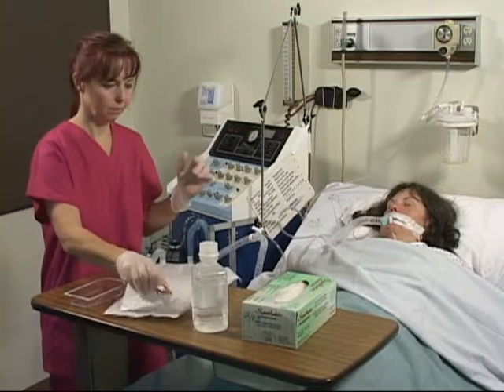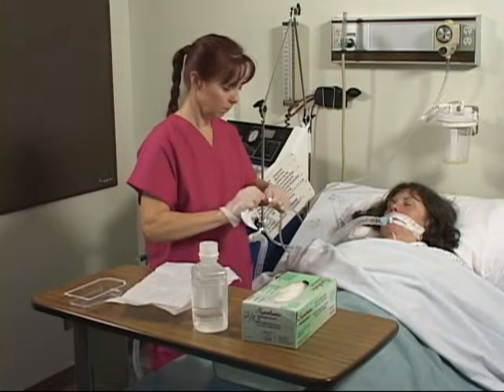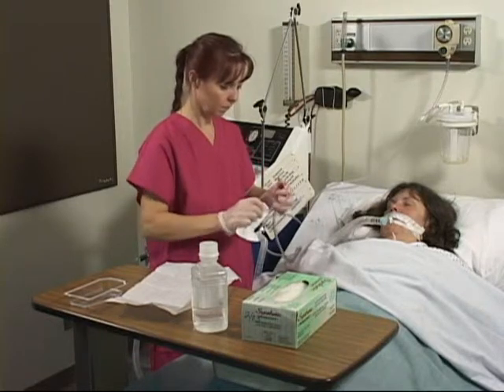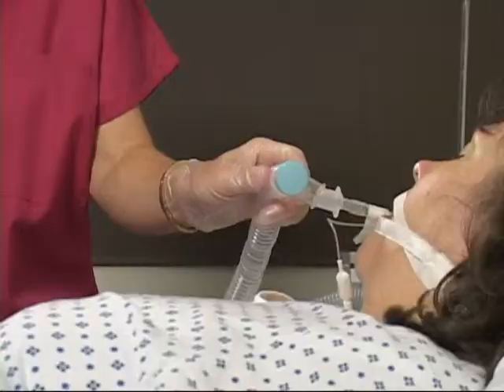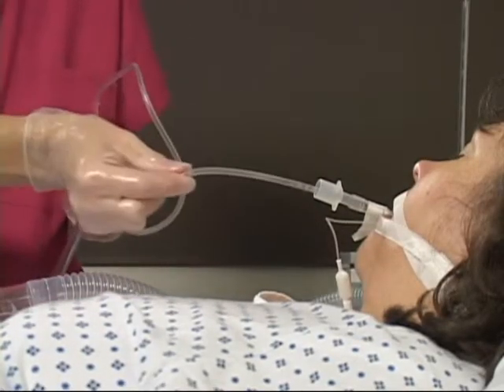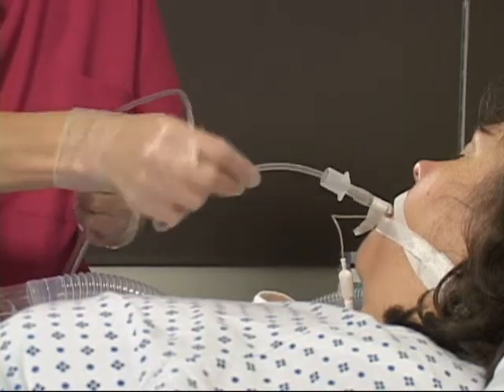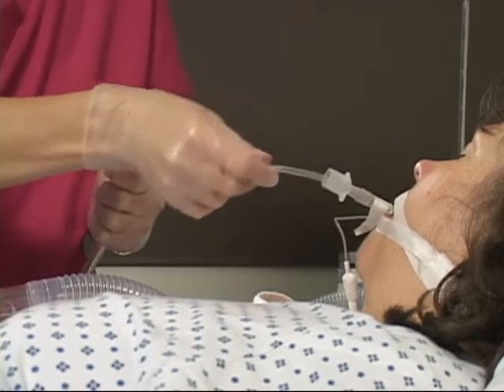Grasping the paper wrapper and the suction catheter, connect the suction catheter to the suction tubing. Remove the paper wrapper from the suction tubing, maintaining its sterility. Disconnect the endotracheal tube from the ventilator. Quickly but gently insert the suction catheter as far as possible into the artificial airway without application of suction.